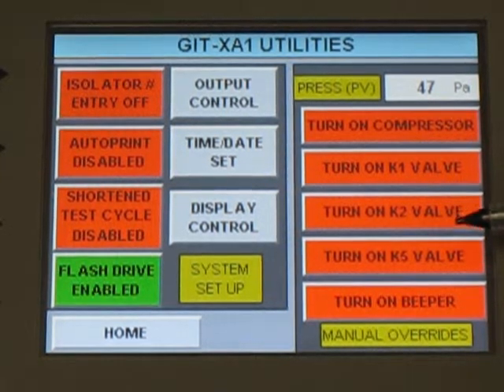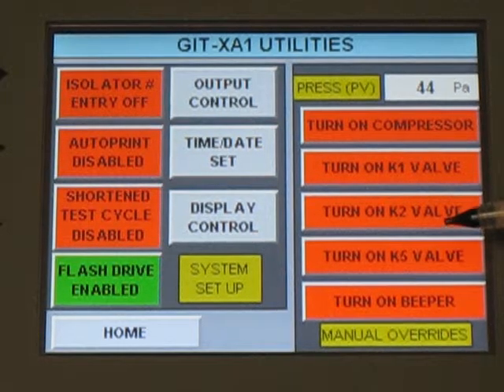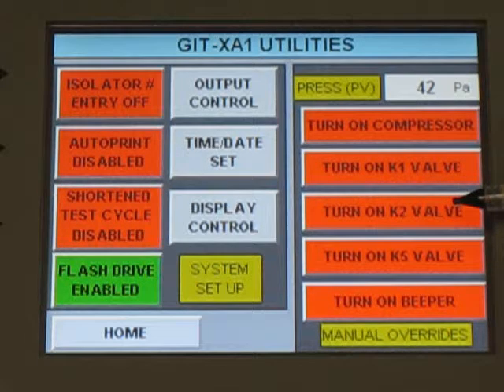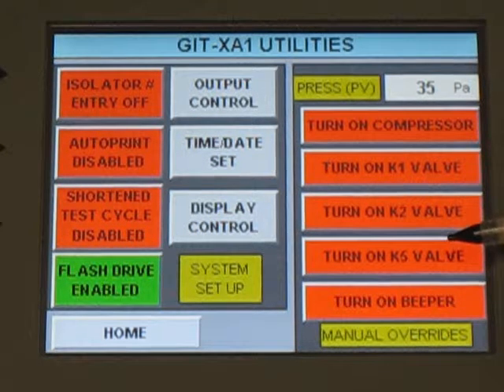So what happens is we overinflate the glove when we first turn it on in order to create a stretch of the rubber. When that period, which is called the stabilization period, is over, then we turn on K2 valve automatically, of course, and that pressure quickly drops towards the starting pressure, which is the pressure at which we're going to start the leak test cycle. As the pressure is approaching the leak test cycle, this valve K2 shuts off and K5 turns on because this is a slow deflate valve.